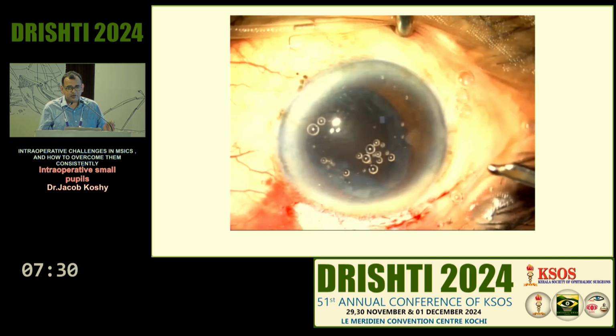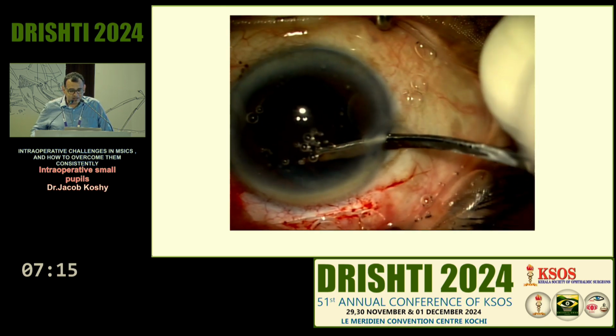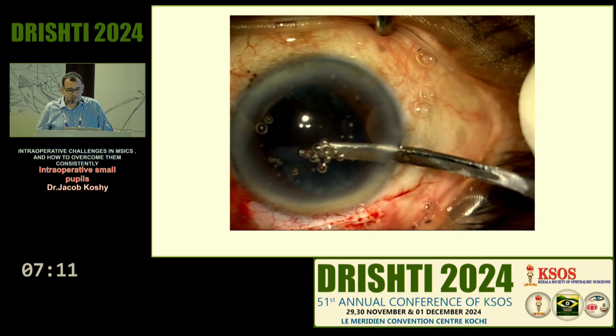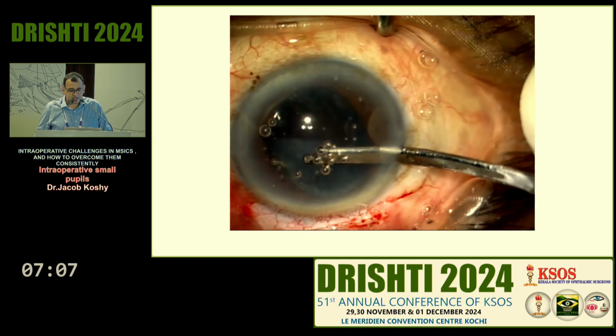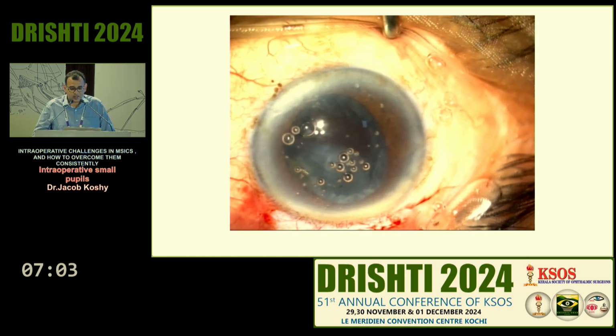And then sometimes you have these cases which, when you have the problem, you start wondering why you became a doctor, or why you took ophthalmology, and sometimes you start wondering why you were even born, those kind of things. And you're doing the case, and then half the nucleus has gone into the vitreous, and you have all kinds of things, and just trying to see what's happening there, and you see that the nucleus is floating in the mid-vitreous cavity, and you're desperate.